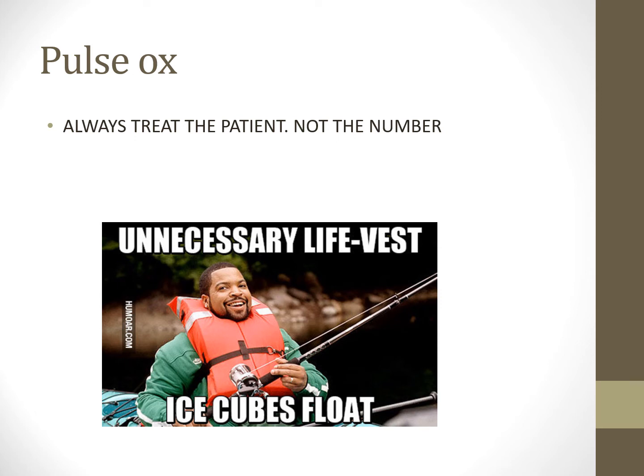So look at the patient first, right? You see a weird number, look at the patient first. Work your way back from the patient. You never treat a monitor. You will always look at your patient first.